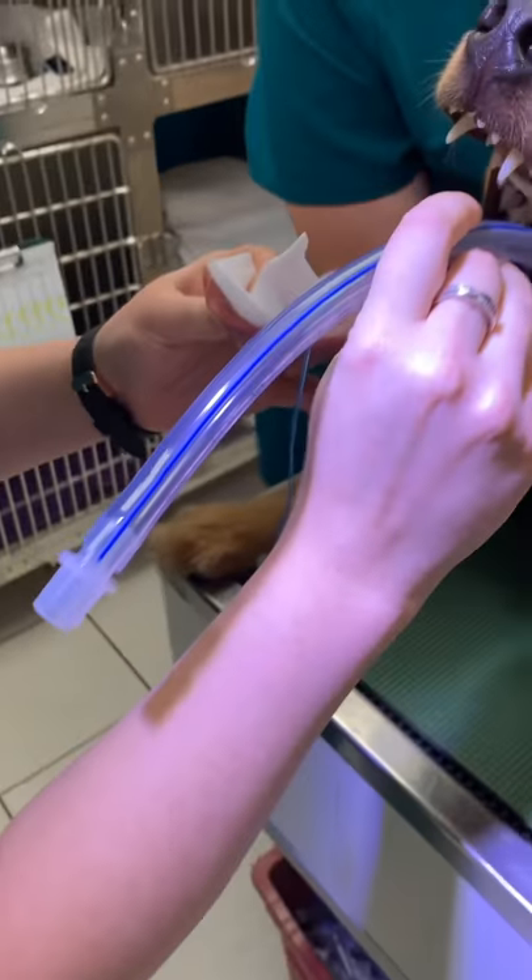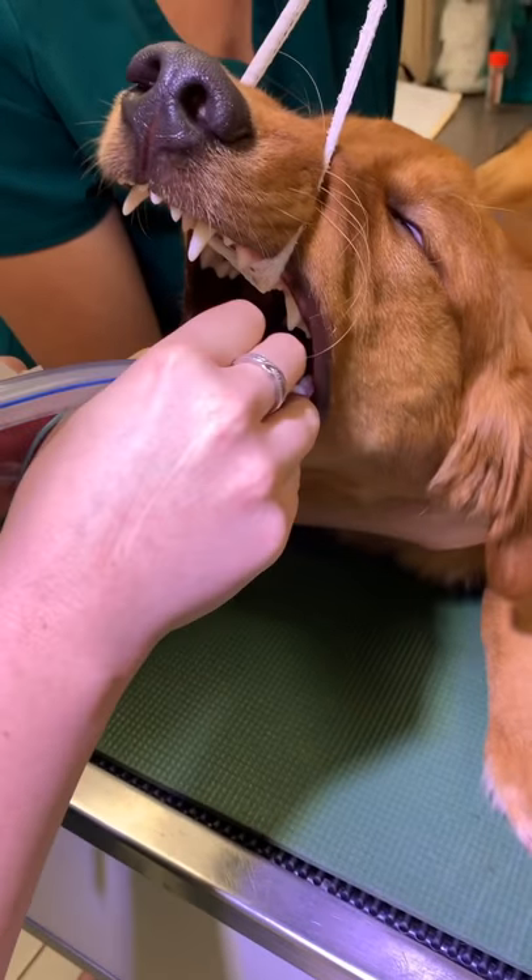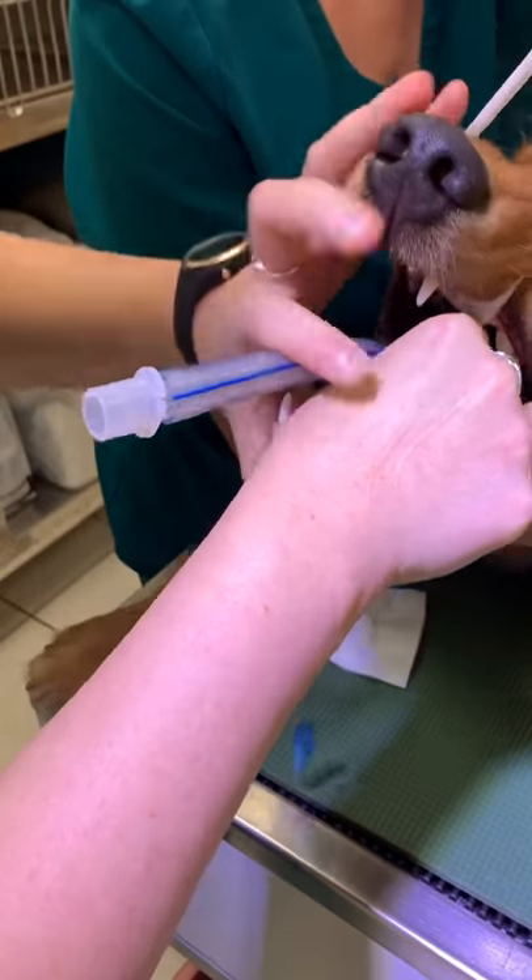So now what we're doing is placing Ollie's endotracheal tube so that we can switch him over to the gas and oxygen anesthesia that he'll need for his procedure.